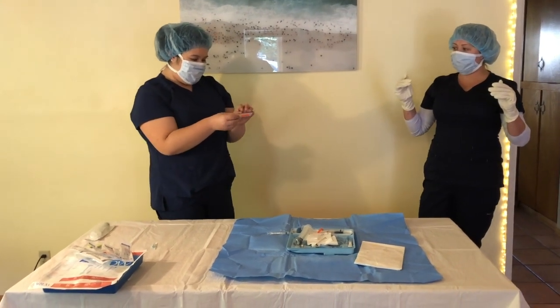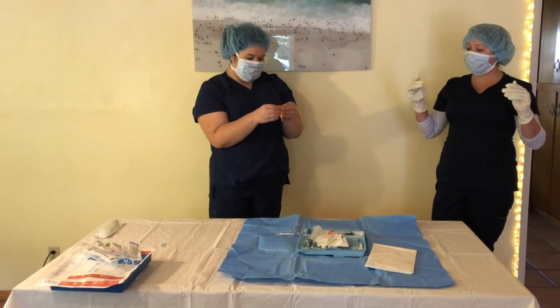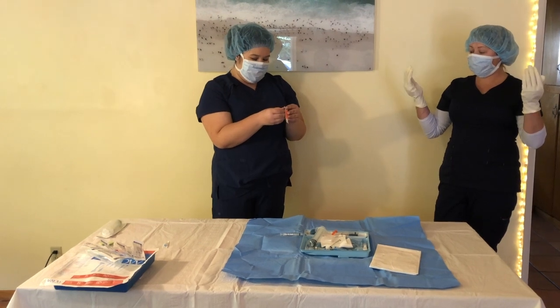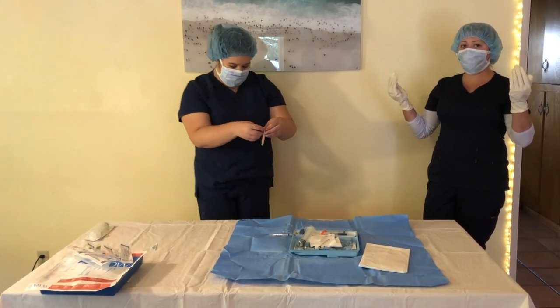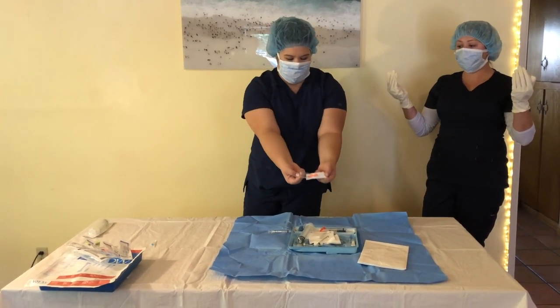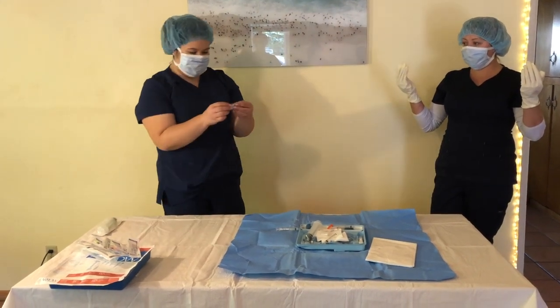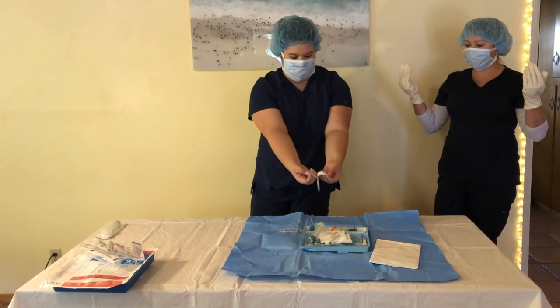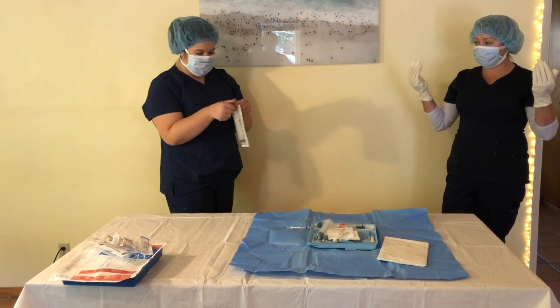Now she's opening the sharps. She already opened the large syringe and the small syringe. We have different size needles depending on what the doctor likes and what the procedure is. So you have to have everything available to them depending on what they need. Here's another sharp. And this is our syringe.